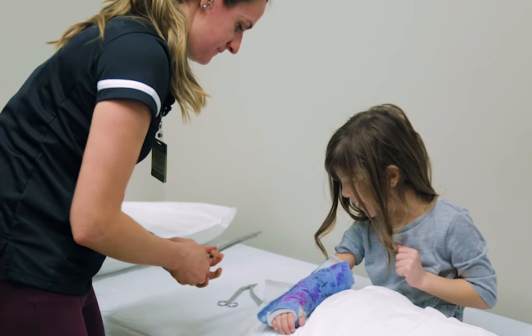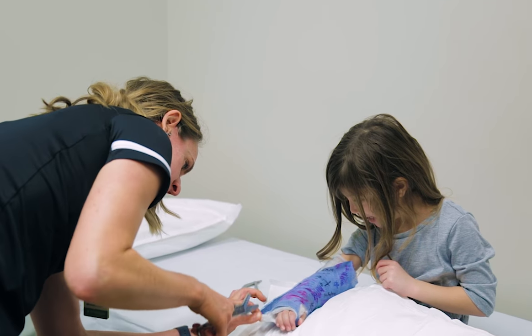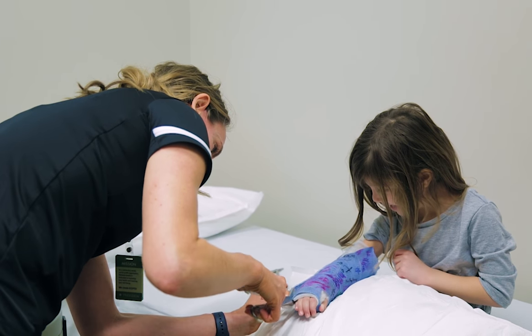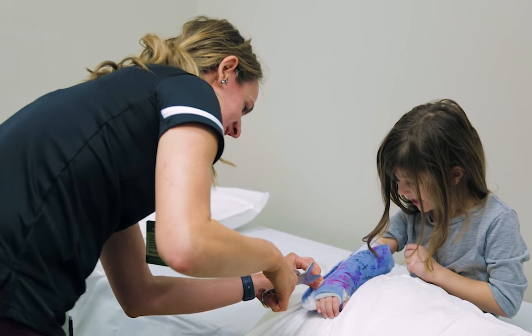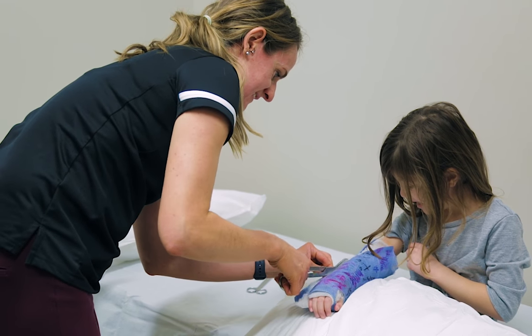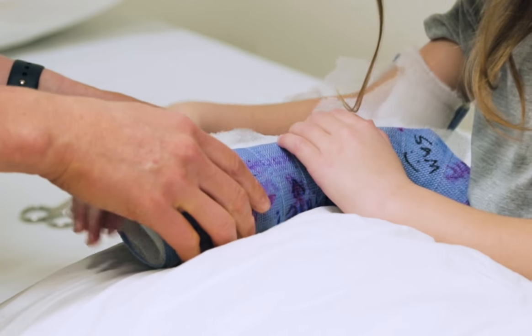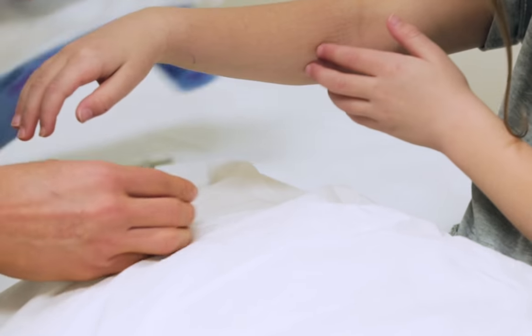Now I'm going to cut it off, okay? So just stay still. Does it tickle? Ready? Good job.